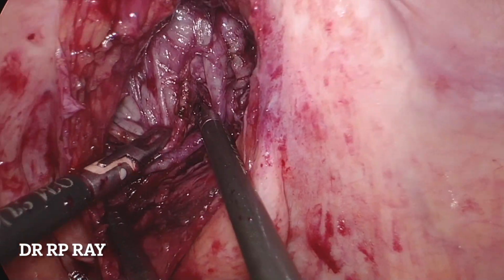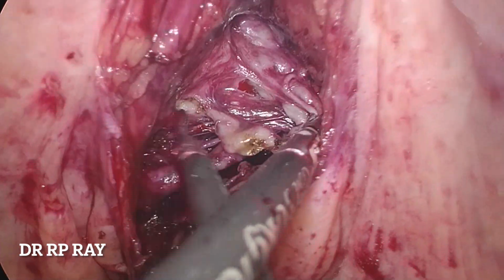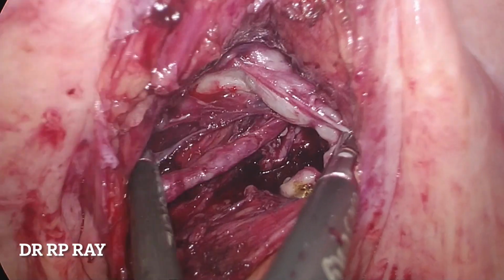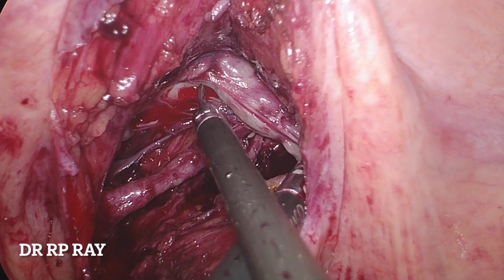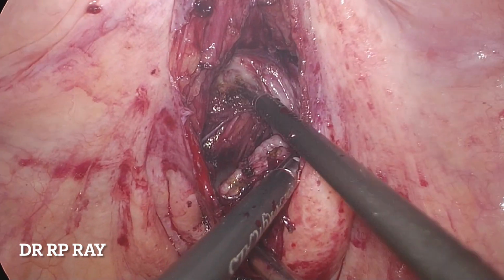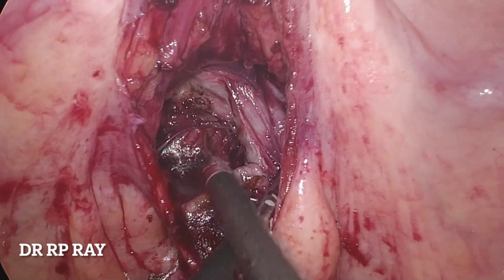Complete dissection of the seminal vesicle is performed so that you can go beyond the prostatic margin, and many times there is an attempt to preserve the tip of the seminal vesicle because the neurovascular bundles are very close to the tip of the seminal vesicle, and in that way some advocate the chance of injury to the neurovascular bundle is less.